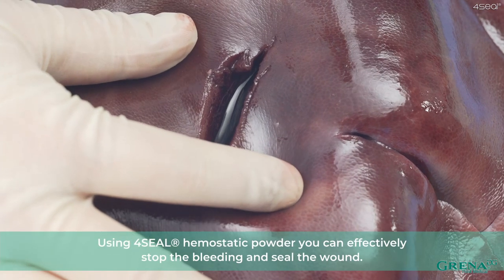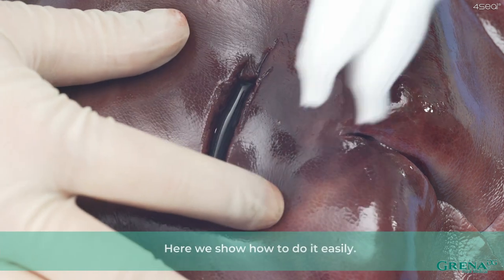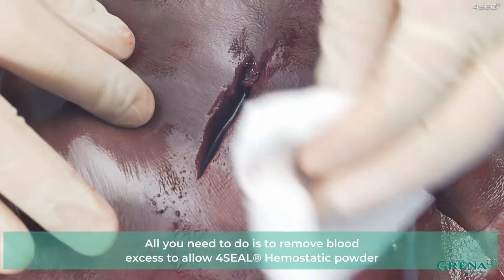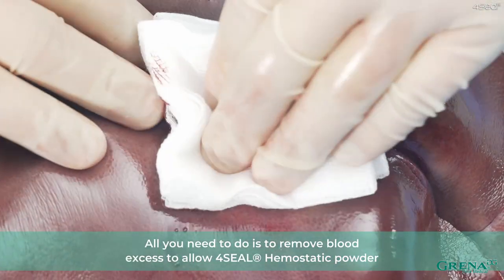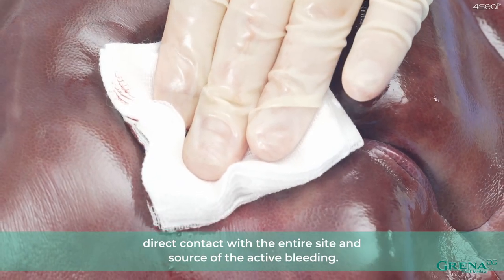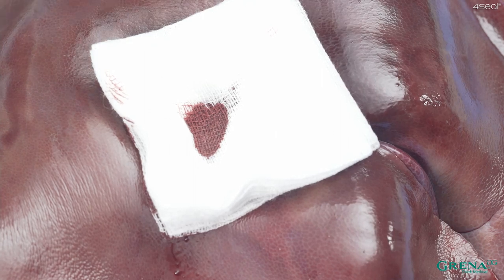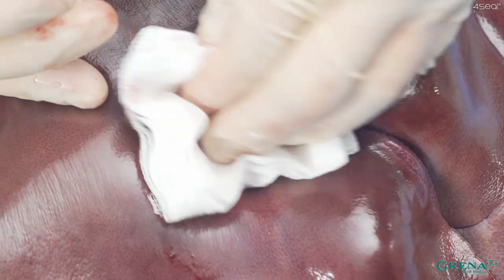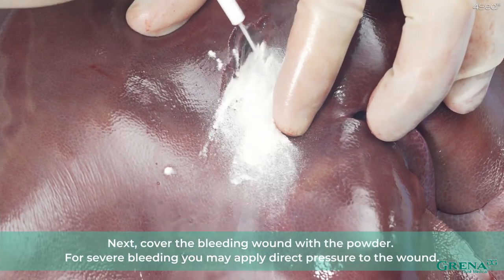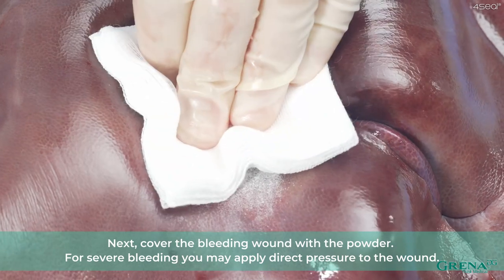Using 4Seal Hemostatic Powder, you can effectively stop the bleeding and seal the wound. Here we show you how to do it easily. All you need to do is remove excess blood to allow 4Seal Hemostatic Powder direct contact with the entire site and source of the active bleeding. Next, cover the bleeding wound with the powder. For severe bleeding, you may apply direct pressure to the wound.